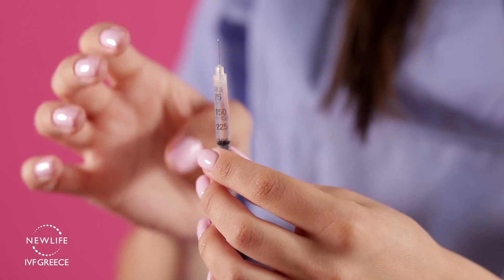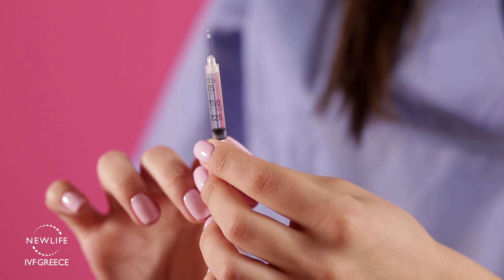Remove the needle from the vial and flick the needle to remove any air bubbles. You are now ready for your injection. This should be done at a set time between 8 pm and 12 midnight to perform the injections daily.